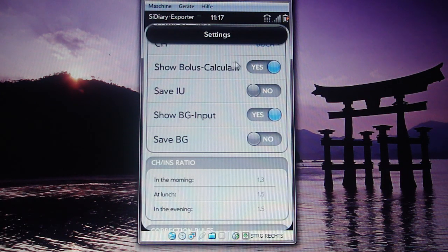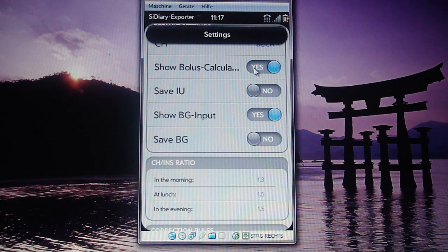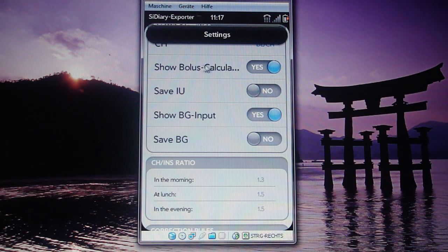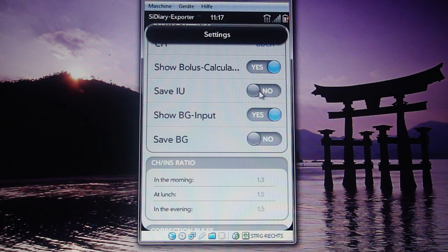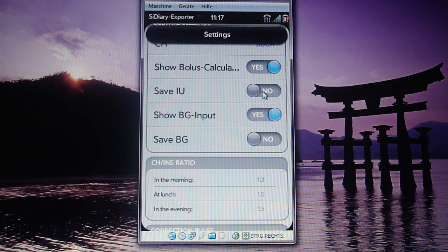Next, if you want to show a proposal for how much insulin you should inject, you can turn it on or off to show this calculation proposal on your input screen. Next is whether you want to save into your profile how much insulin you injected. I set it to off because I read out my insulin pump into the tool, so I don't need to save it manually on my device.